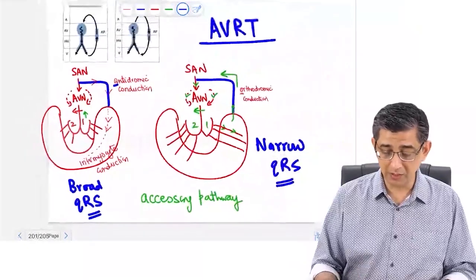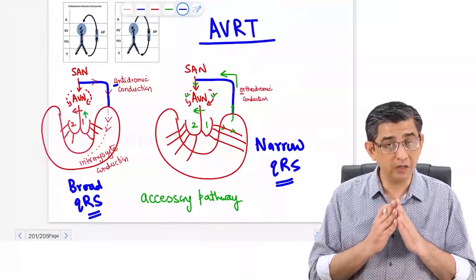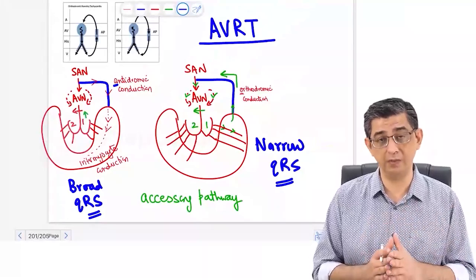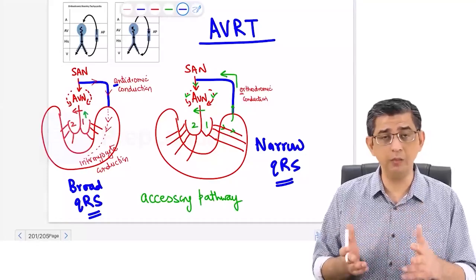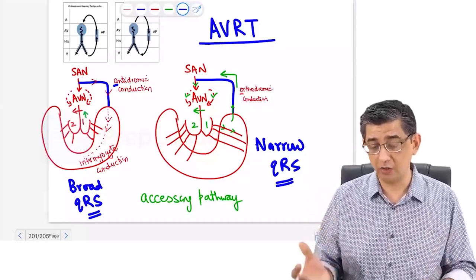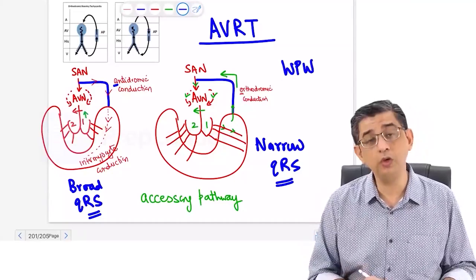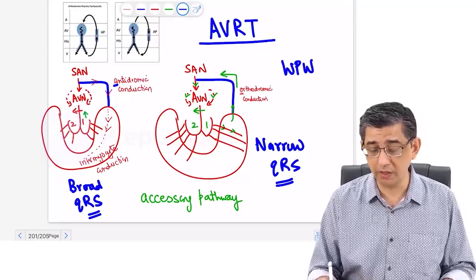These two terminologies have been added to your vocabulary of Wolff-Parkinson-White syndrome. The main crux of the discussion again is that WPW can conduct both forwards as well as backwards, so you should be familiar with the terms. And the speciality is WPW. Anyway, I told you there's going to be a broad QRS complex due to intermyocyte conduction. I've taught you a peculiarity that with Wolff-Parkinson-White syndrome, there can be a narrow QRS complex tachycardia also. How? Only if there is a retrograde conduction.